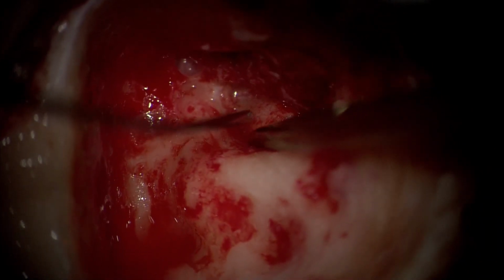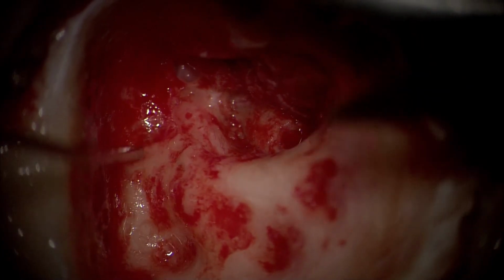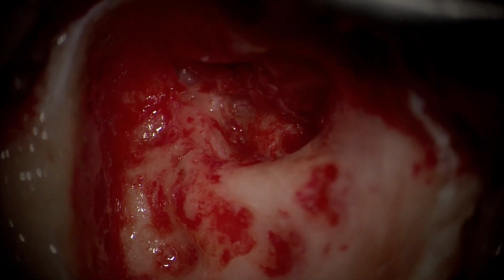The purpose of this video was to explain and elaborate the soft tissue dissection techniques in this part of the mesotympanum, the posterior mesotympanum, which needs to be separately addressed apart from just going through the techniques of bony drilling. They are separate, and soft tissue work is quite separate.